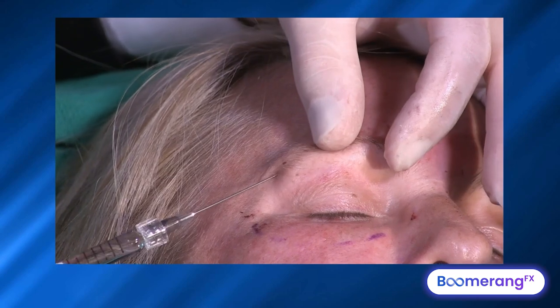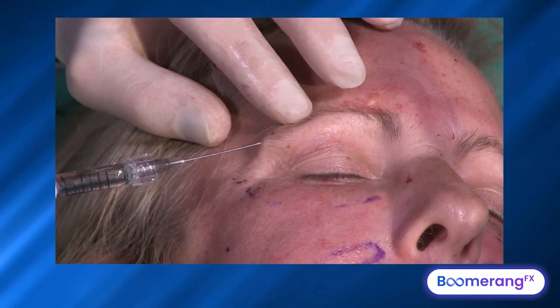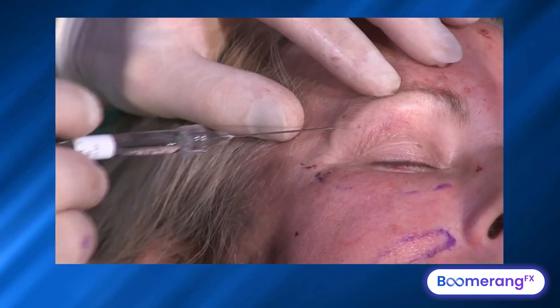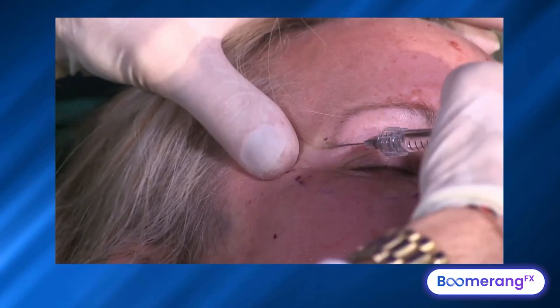About 0.3 cc's here in the lateral tail of the brow. If I also want to get her temporal hollow, I can go from here, turn, and use that same port to rotate and pop right through the temporal parietal fascia and be right down into her temporal hollow. Inject a little bit in the middle and massage that in.